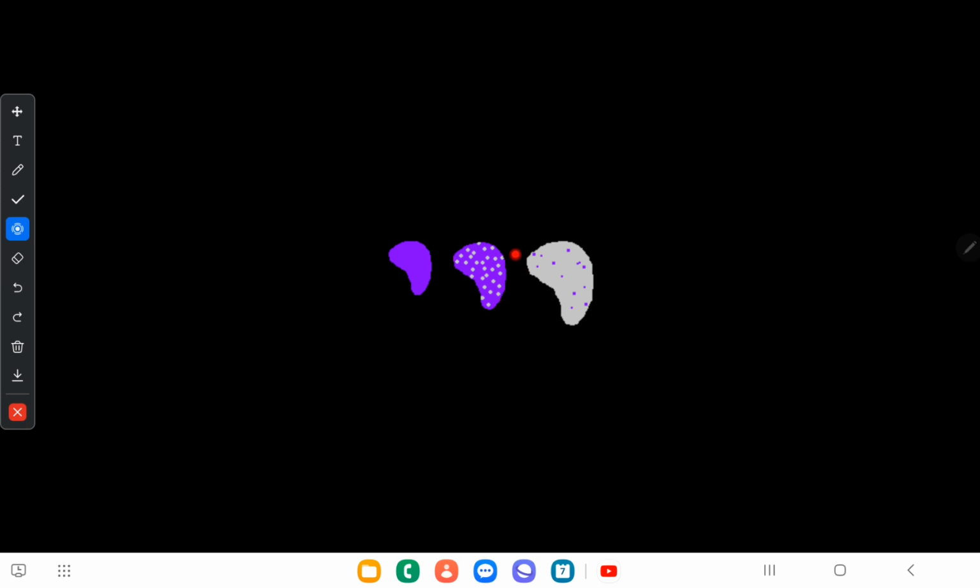In sago spleen, amyloid deposition takes place only in the splenic follicles. The whitish material is amyloid protein, deposited only in the splenic follicles. These amyloid proteins are shown as whitish dots here. This is sago spleen, and it is only moderately enlarged with a dotted, sago-like appearance.